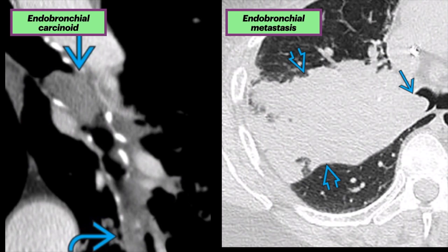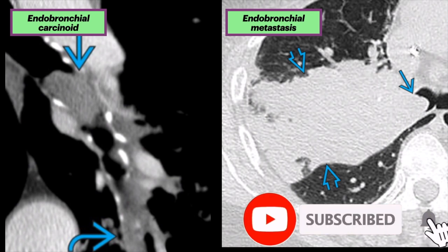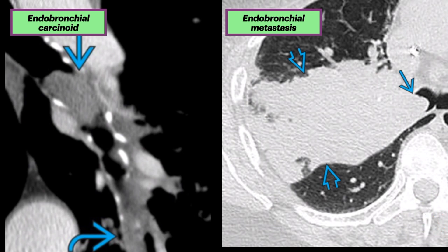Last are endobronchial lesions. On the left we see a CT of an endobronchial carcinoid. There is a central obstructing left lower lobe carcinoid tumor with resultant peripheral lower lobe atelectasis. The carcinoid tumor may be entirely endobronchial as in this case. The right-hand axial CT shows a patient with renal cell cancer and a right upper lobe consolidation and volume loss, all due to a central endobronchial metastasis completely obstructing the right main stem bronchus.